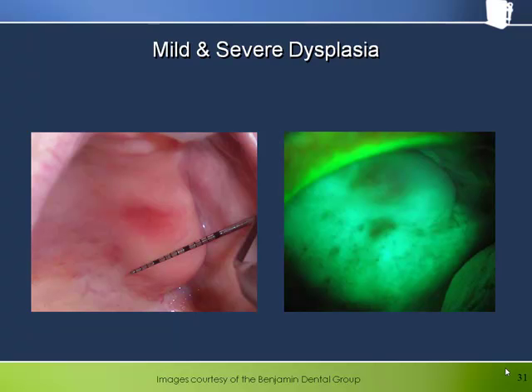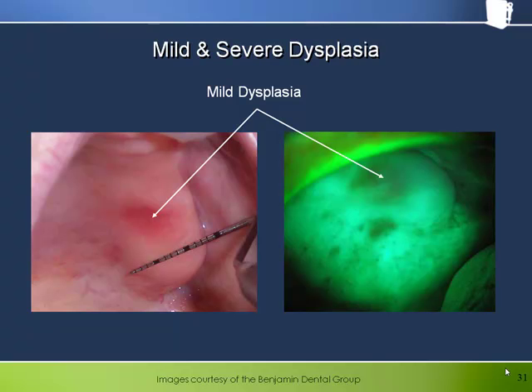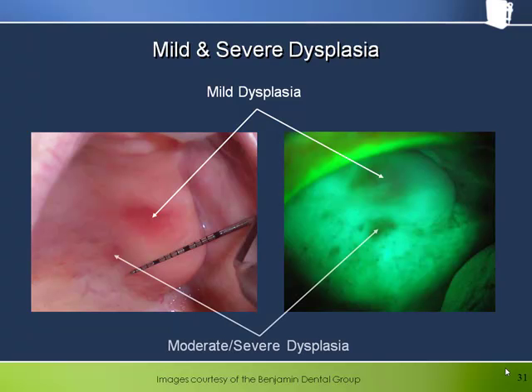The larger, more obvious area in white light was confirmed by biopsy to be mild dysplasia. The smaller, less obvious area under white light, which looks darker with more well-delineated borders under Velscope, was found by biopsy to be moderate to severe dysplasia.